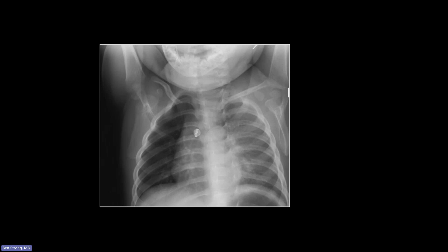When you assess any chest X-ray for rotation, look at those clavicular heads. You can see they do not line up to the left and right symmetrically of the vertebral bodies — there is clear rotation there.